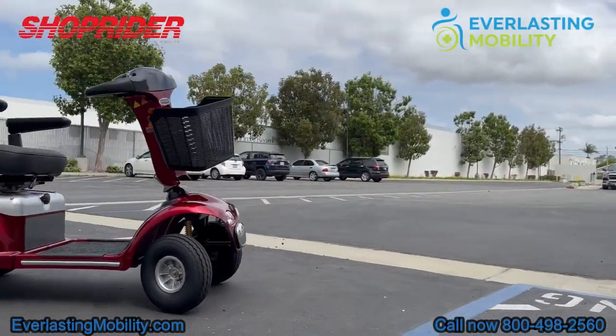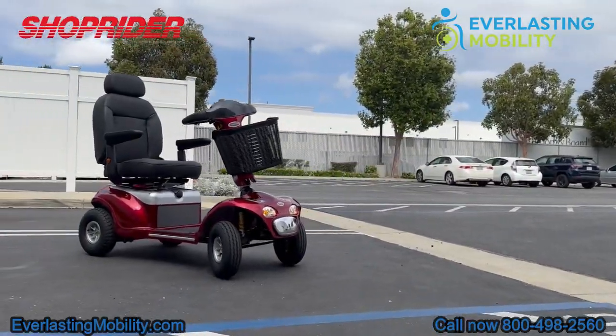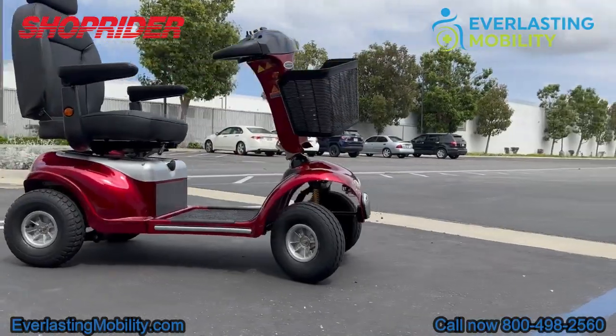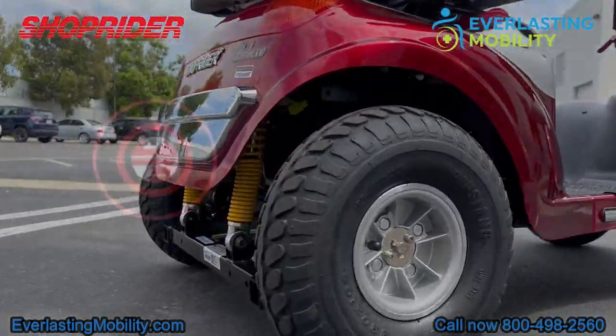The Enduro XL4 is a blend of strength, comfort, and distance. It is your ideal companion and is made by one of the best brands in the powered mobility industry, which is ShopRider.